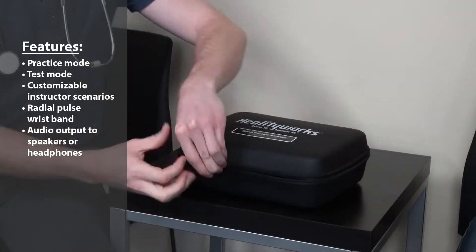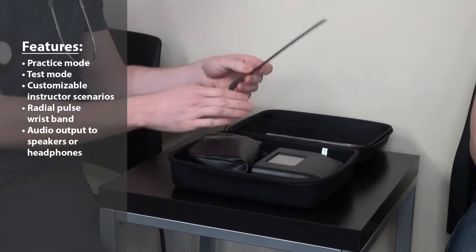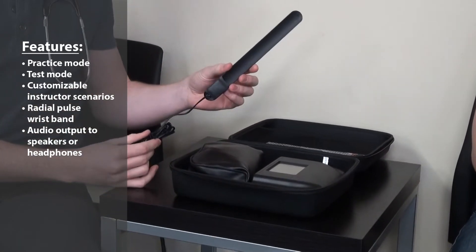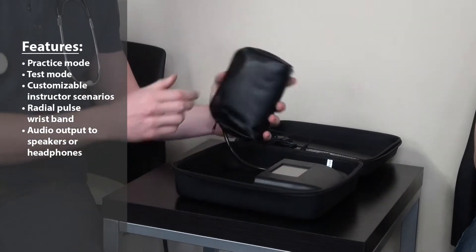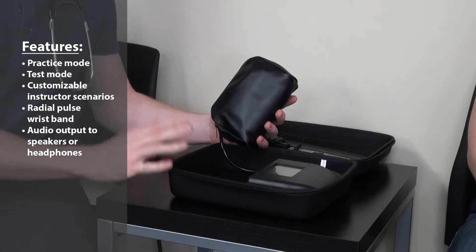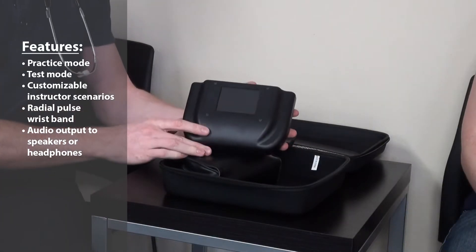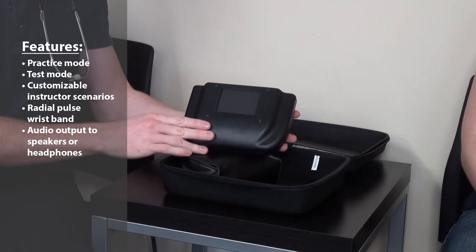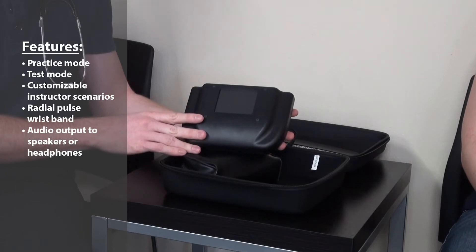Included is a pulse wristband for measuring the radial blood pressure, a standard adult cuff that does not inflate as to not cut off circulation in the students, as well as a comprehensive user interface that generates random practice scenarios as well as ten programmable testing scenarios.